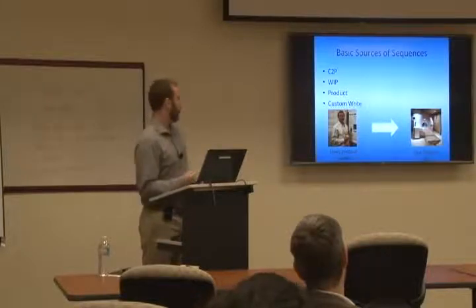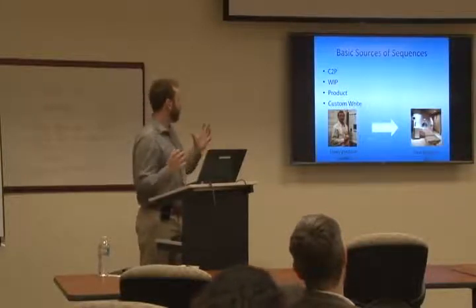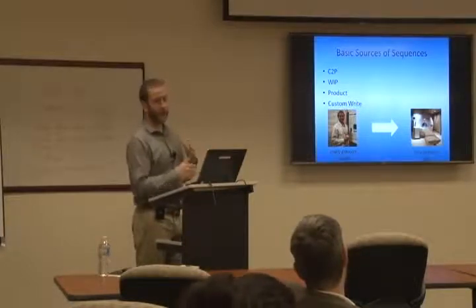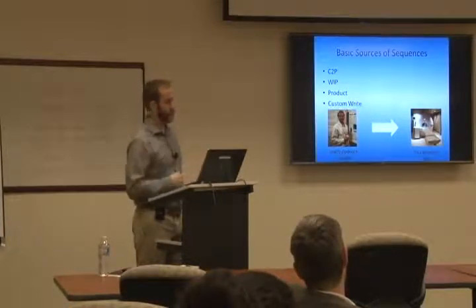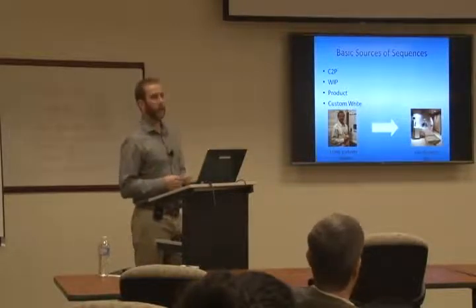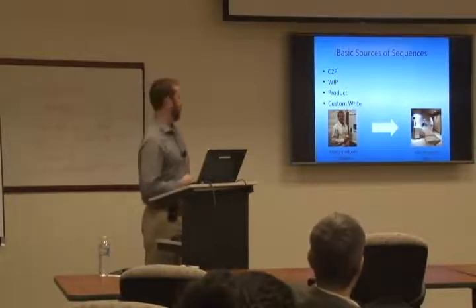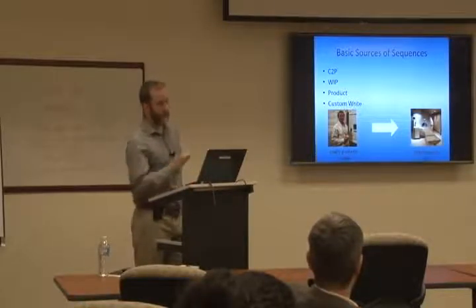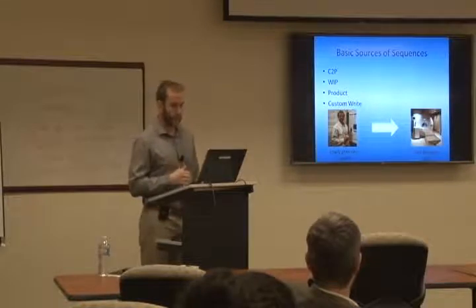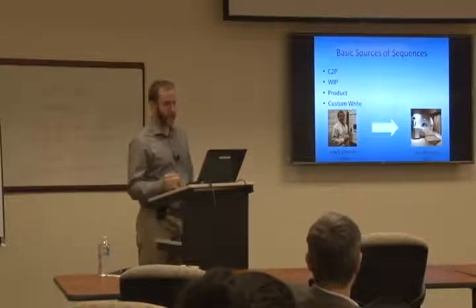And once you have written your own code, you have full control over it. You can decide what parameters you want to play with, and it's a very good way to get your hands dirty with the MRI and to really understand how the MRI works. And there are courses you can take that cost money, but they are helpful.